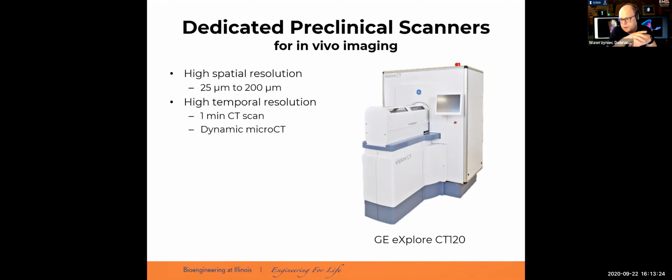In case of the preclinical systems, because we don't have this very high speed rotation of the gantry around the animal, it's a couple of minutes. But this system allowed us to decrease the scanning time to 1 minute. So it allowed for dynamic micro CT images.